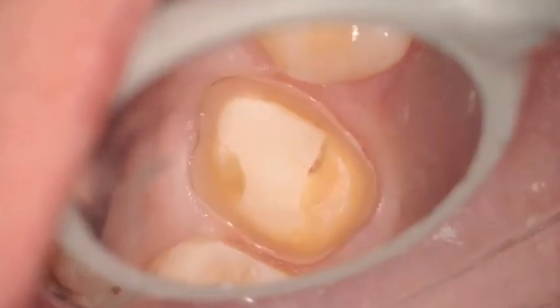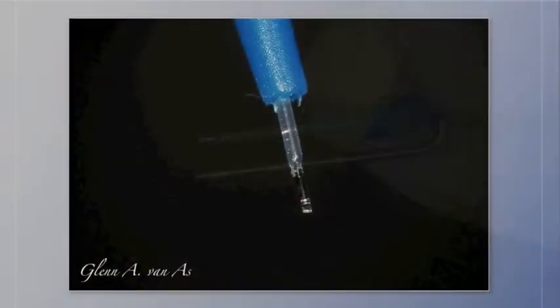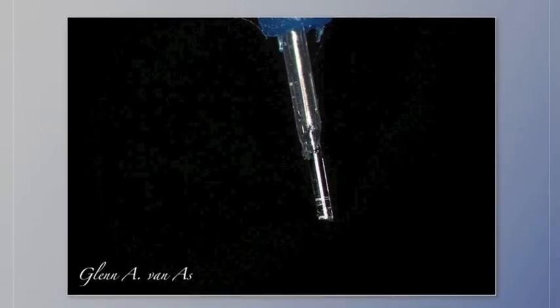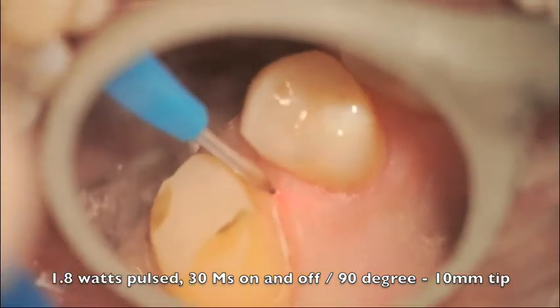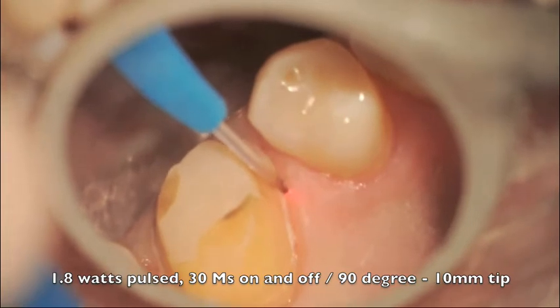We're thinking about using the laser. The fiber was picked. The tips were 10 millimeters in length. You can see it's pre-cleaved here and ready to be initiated. Here's a video, and you can see that we use 1.8 watts pulsed with a 90-degree tip of 10 millimeters in length. They come in 5, 10, and 15 millimeters in length.